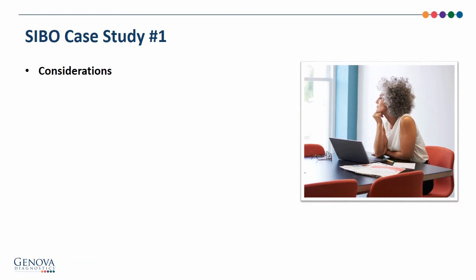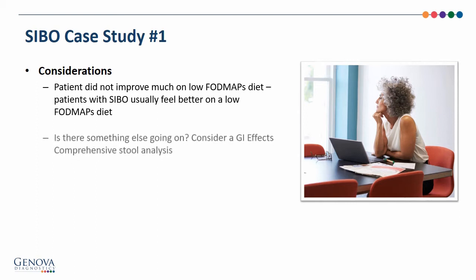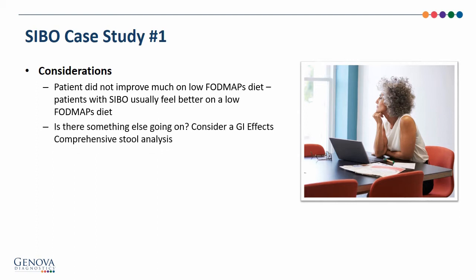Let's talk about some considerations for this case. One is that the patient did not improve much on a low FODMAPs diet. Patients with SIBO usually feel better on a low FODMAPs diet, so we wonder if there's something else going on. Further testing might include a comprehensive stool analysis to look at biomarkers that may identify the cause of her symptoms.